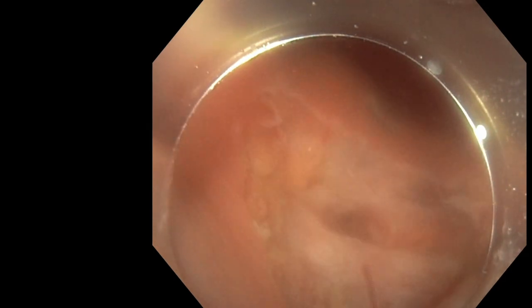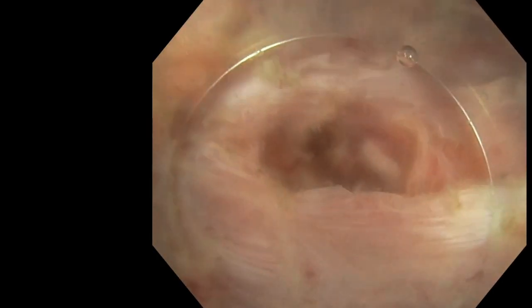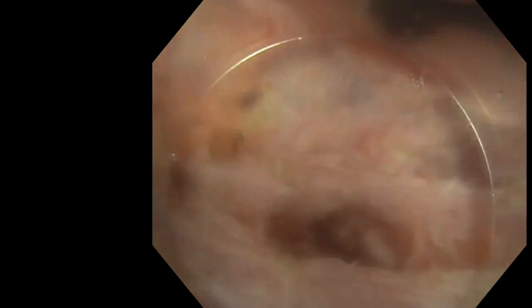So the water is not very clean, so I tried to remove the dark water and change it for clean water in order to see better. Once again, you see the bottom of the diverticula, which is not free of anything. There is a tissue at the bottom.